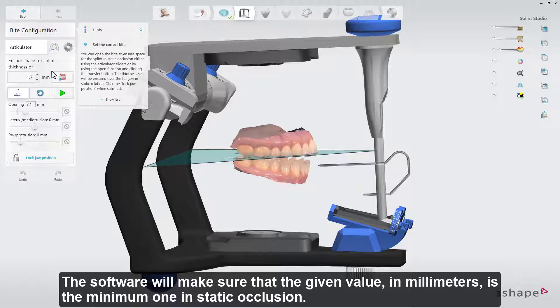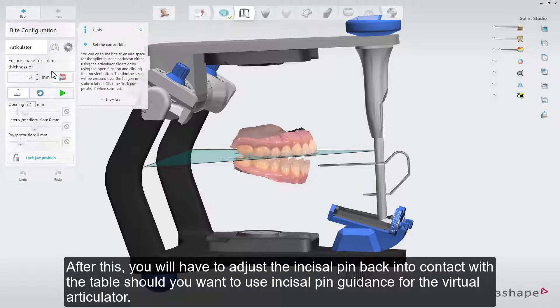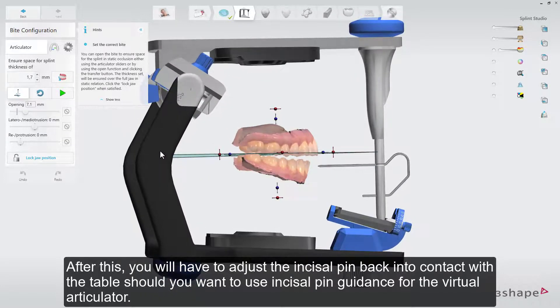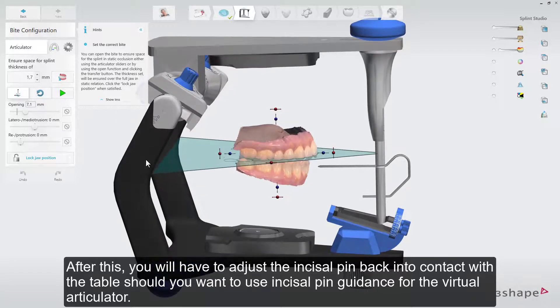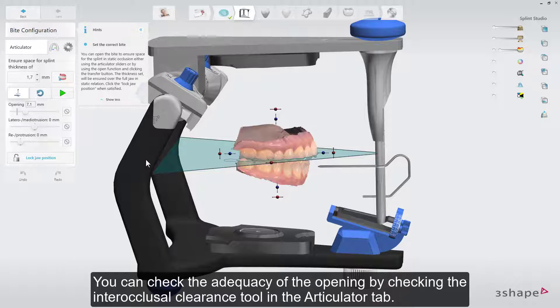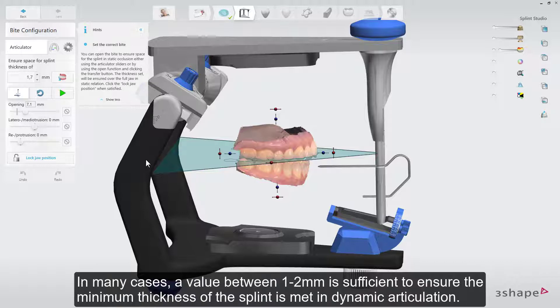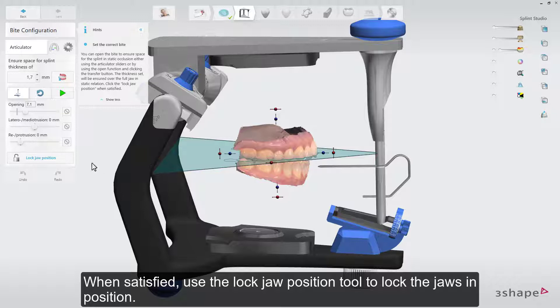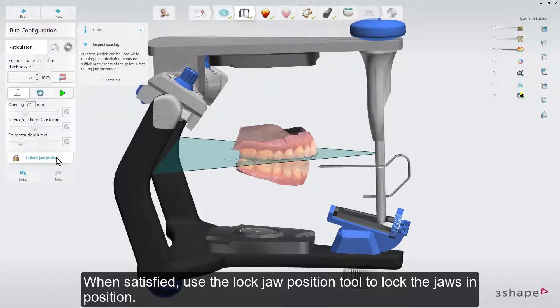Another way to achieve the same result is to use the inter-occlusal clearance tool to automatically open the bite to a certain minimum thickness. The software will make sure that the given value, in millimeters, is the minimum one in static occlusion. After this, you'll have to adjust the incisal pin back into contact with the table should you want to use incisal pin guidance for the virtual articulator. You can check the adequacy of the opening using the inter-occlusal clearance tool in the articulator tab. In many cases, a value between 1 to 2 mm is sufficient. When satisfied, use the lock jaw position tool to lock the jaws in position.